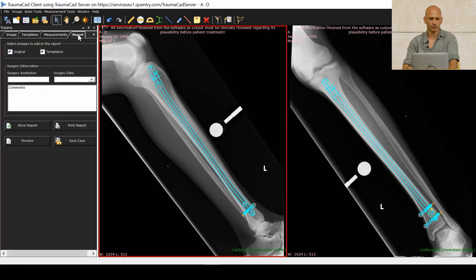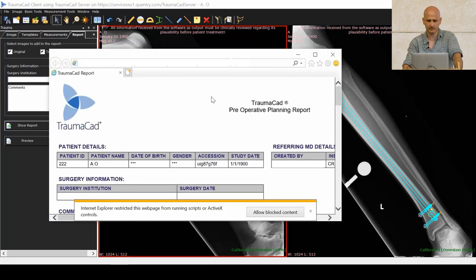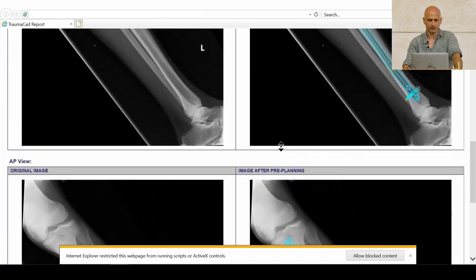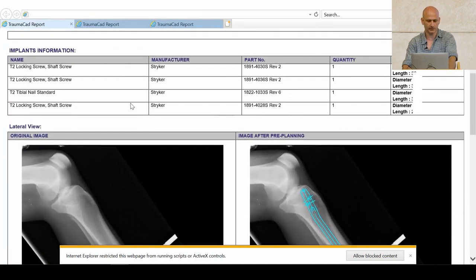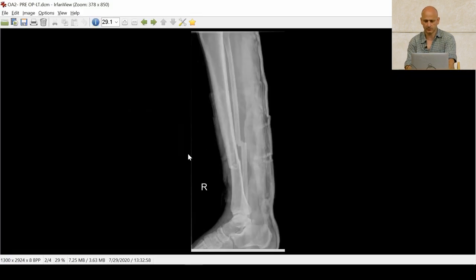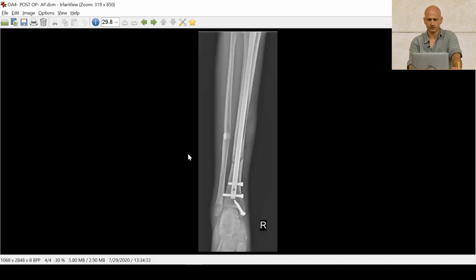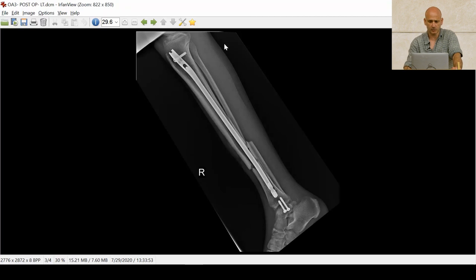Now I choose the report, preview it, and can export it into the PACS system to be saved. This is the technical report — you can see both views with all the technical data and numbers, and we can compare it to the surgical results. You can also see the medial malleolus fixation using cannulated screws, and the results are quite matching. This entire process takes only three to five minutes and can save you a lot of time, energy, and radiation. Good luck with that. Thank you.